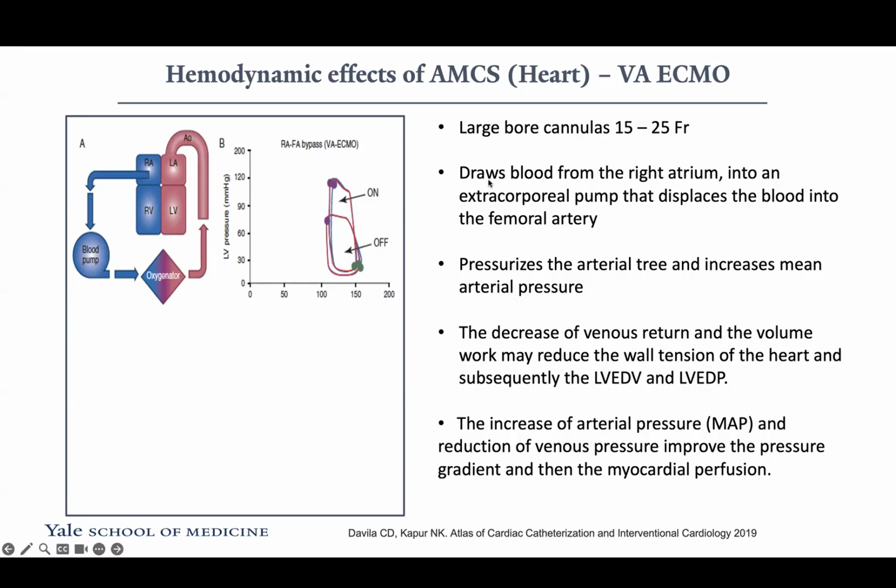Jan, you're critical care. It depends on the circuit, but typically the RA goes to the oxygenator, there's exchange of O2-rich blood, and then it goes into the arterial circuit. It's usually a femoral system for us. From surgeons, it's usually central, but for us, it will be femoral to begin with.